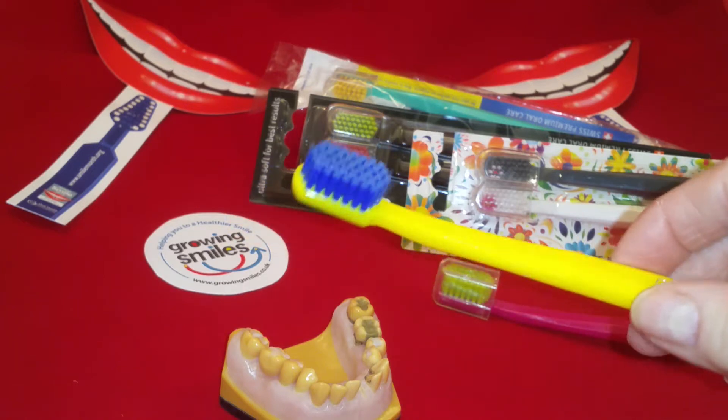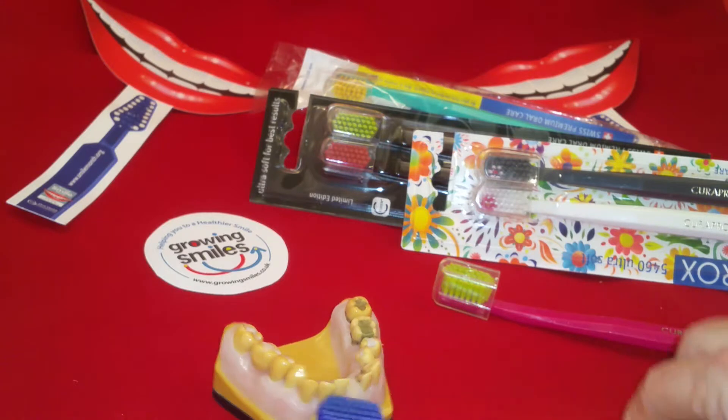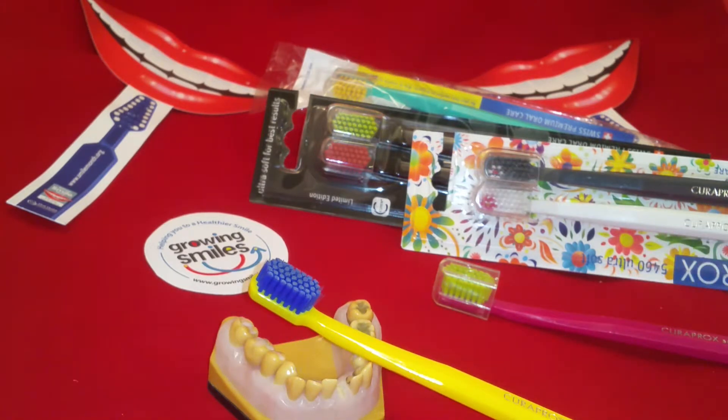So why choose this toothbrush? Well, if you like a manual brush, there's a lot of power packed into a very small head here. It's got 10 times more bristles than your average toothbrush, so that tends to make it more effective at its cleaning action. Most brushes have around a thousand bristles — this has got 5,460 filaments, making it much more condensed and much more effective. It's very gentle on the tooth surfaces and the gums, so great for anybody with recession or sensitivity, or at any sort of risk of tooth surface loss, whether that be acid erosion, attrition, or abrasion.